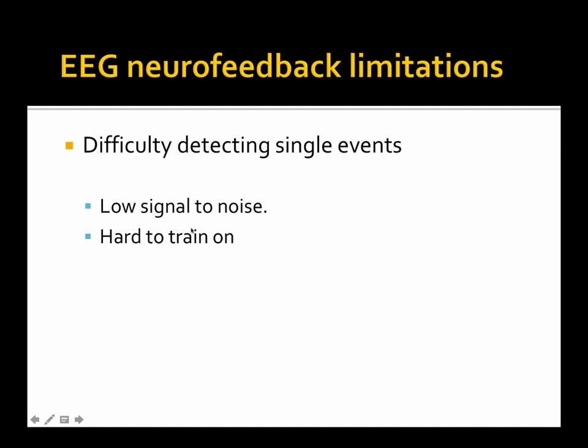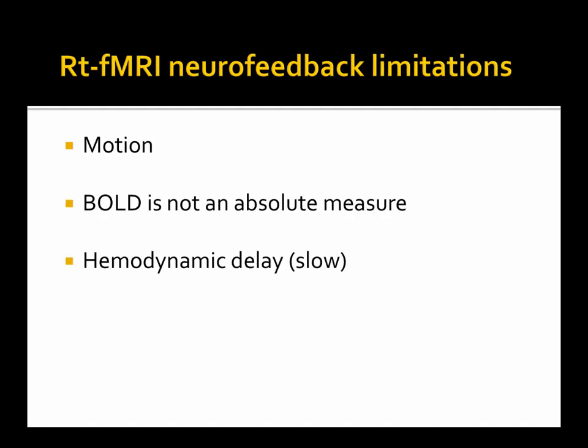And this is a common issue with, as you probably heard, brain-computer interface, where you're trying to get the subject to control a machine based on the electrical waves. This is the same. It's not something easy, even though you can have all the electronics to move an arm or move a leg. It's hard to get the synchronization with the brain to just give that command. So this is the same principle.